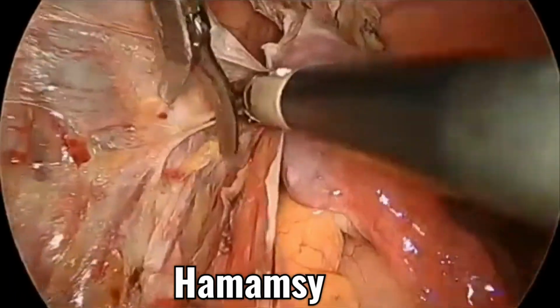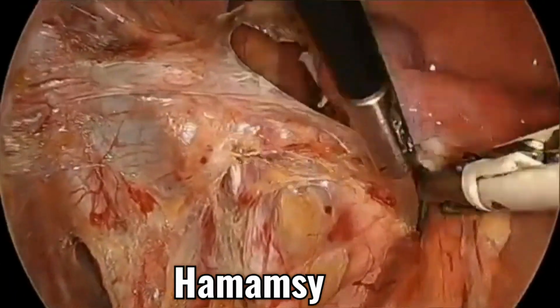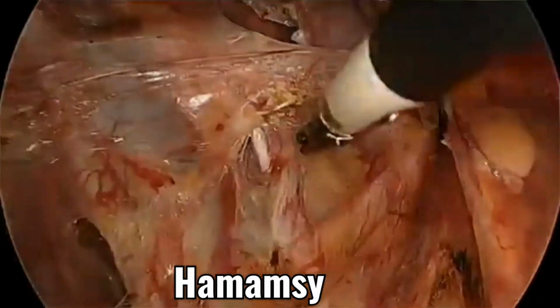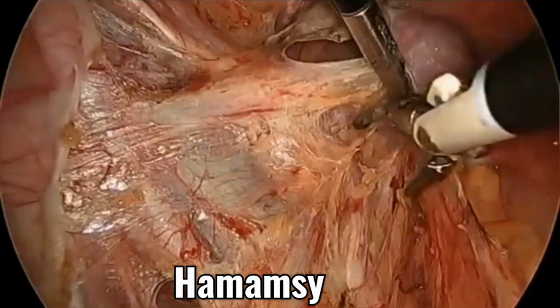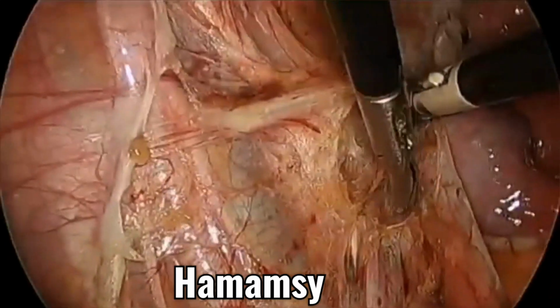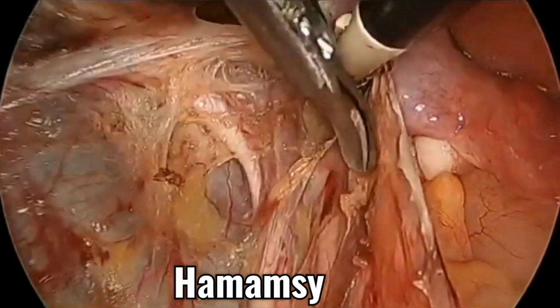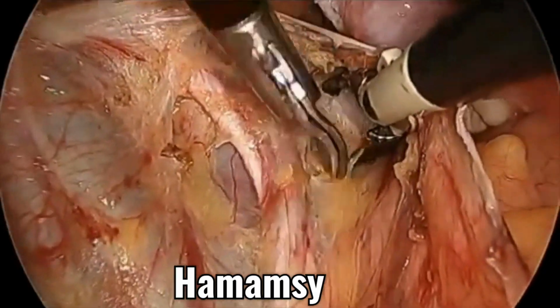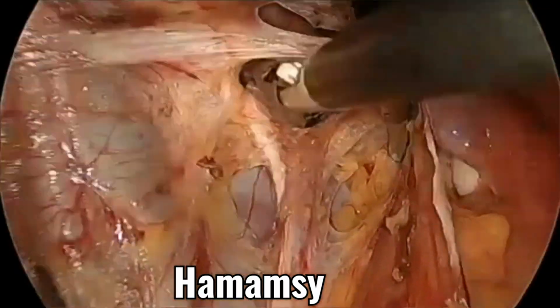Then you can dissect the peritoneum اهو in sweeping manner, fatty tissue your friend, as you can see. Then I will go through the lymphatic tissue and lymph node dissection.